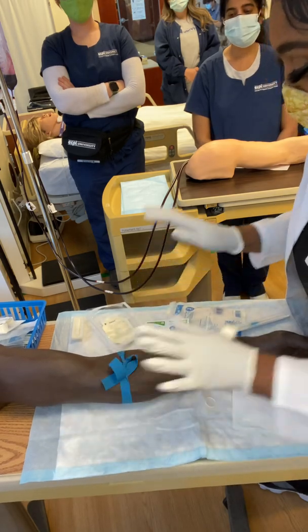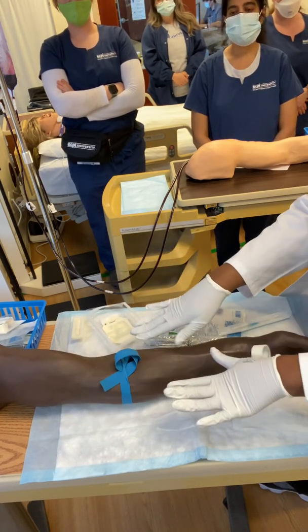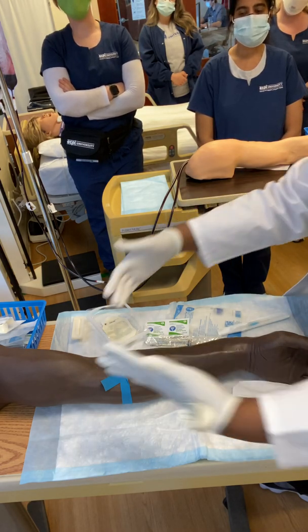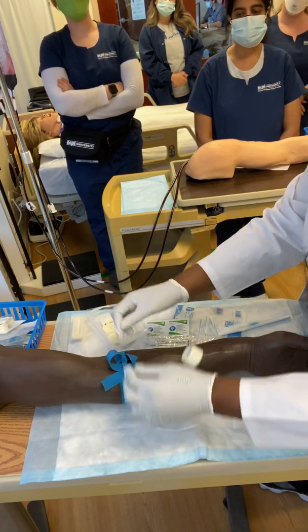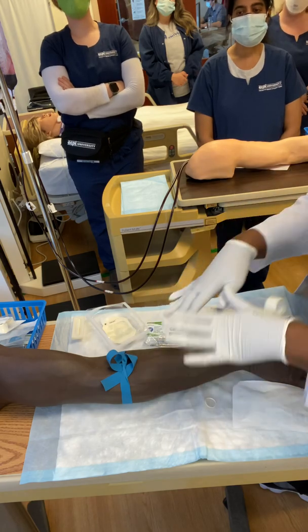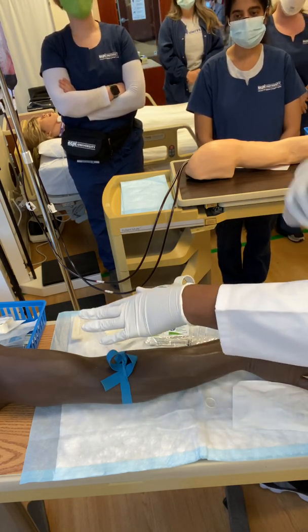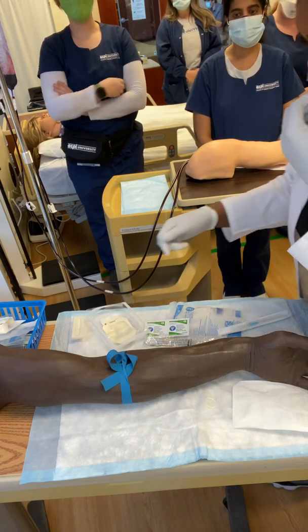All right, so now we have our tourniquet. And we don't do it really overly tight. If it was a frail patient, we would maybe put their sleeve over it so that we minimize any bruising or additional pain. It can be so tight that their skin could bruise as well.